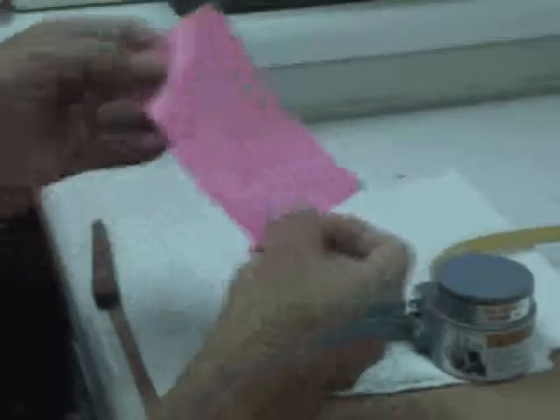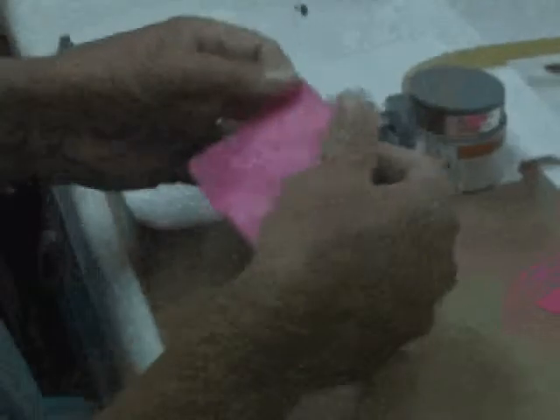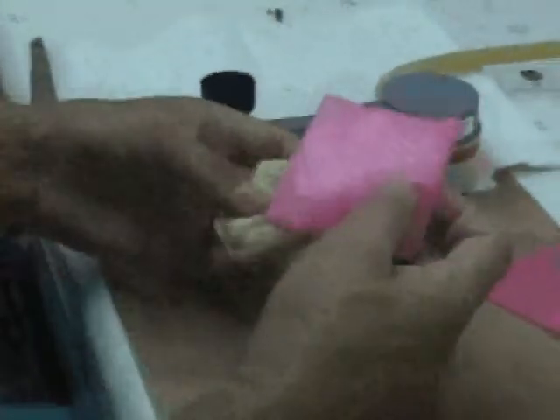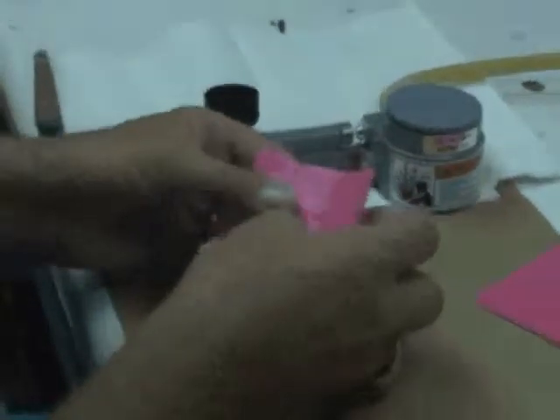The first step in the aesthetic control base is to warm up the wax, and then you fold it in half. So you get this material. See how it doesn't flake when you warm it up? It just stays nice and pliable, and it adheres to itself. And what we're going to do is stretch it a little bit here, and then put it over the palate and just place it down and mold it to the stone as you go around.